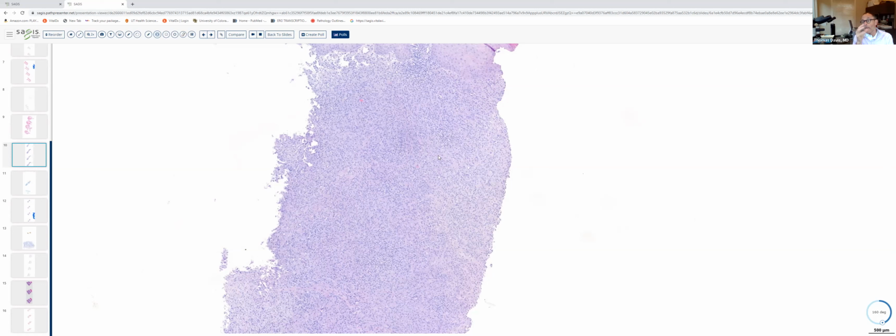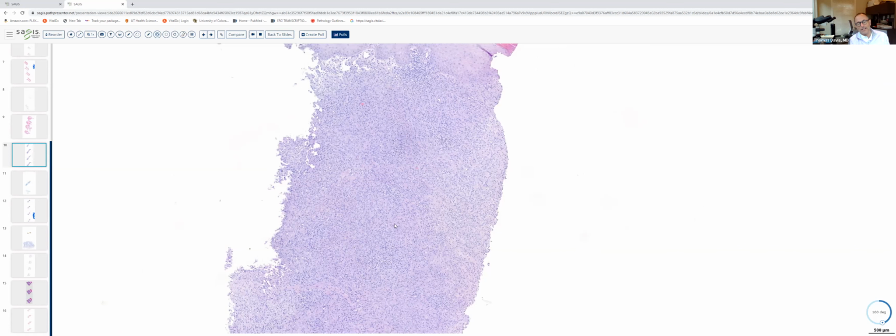And so the other big category that one needs to think about when one encounters suppurative and granulomatous inflammation like this, of course, is infectious processes and deep fungal infections, sometimes bacterial infections like nocardia or mycobacterial infections can all cause suppurative and granulomatous inflammation in the skin. I will tell you here, and hopefully you didn't spend too much time looking, there were no readily apparent organisms that were present in these H&E stained sections.